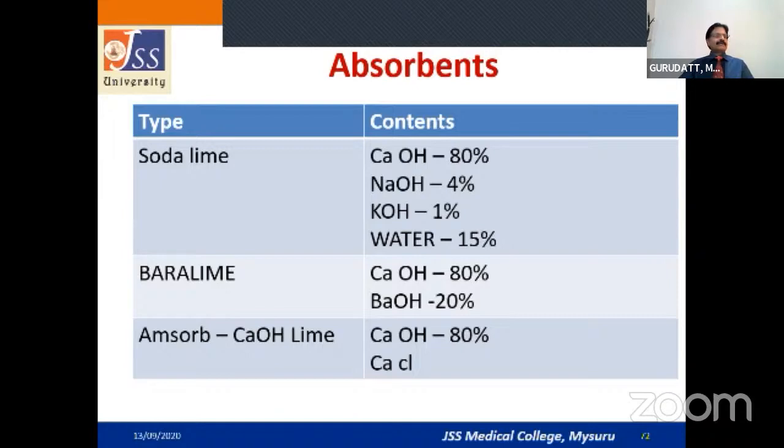The third one, which is nowadays becoming popular, is Amsorb, which does not contain sodium hydroxide or potassium hydroxide. It contains only calcium hydroxide, near 80%, and calcium chloride.